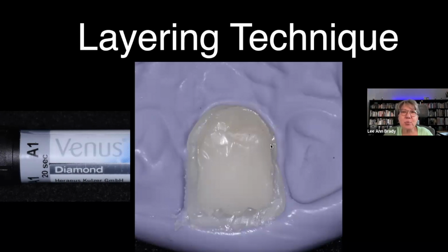I've actually used a plastic instrument. I've incorporated what we call the lobes of dentin so that you're going to be able to see that through the composite to mimic nature. And then you're going to light cure these layers. Again, notice my dentin colored composite is not all the way to the interproximal. That should be pure enamel.